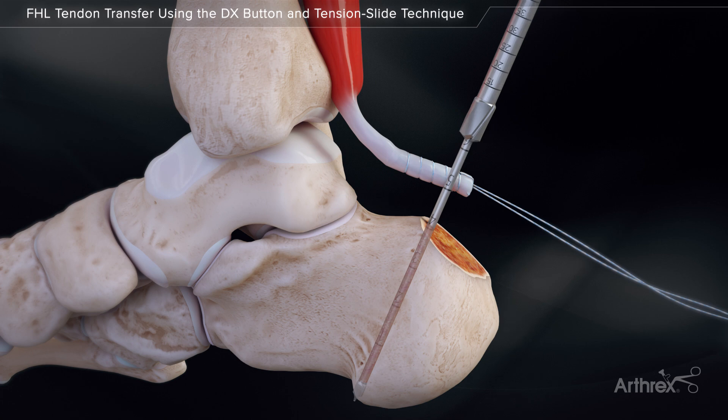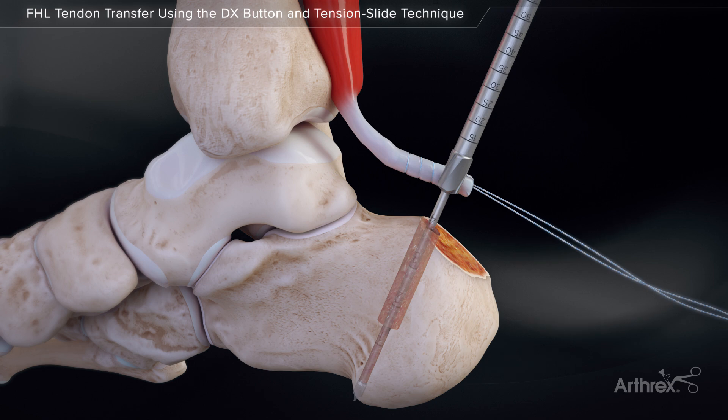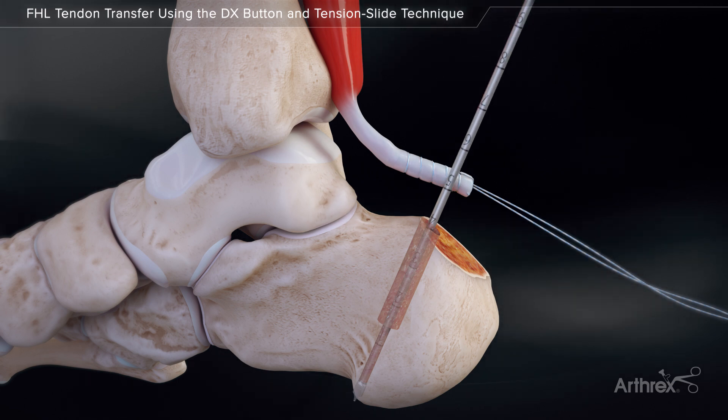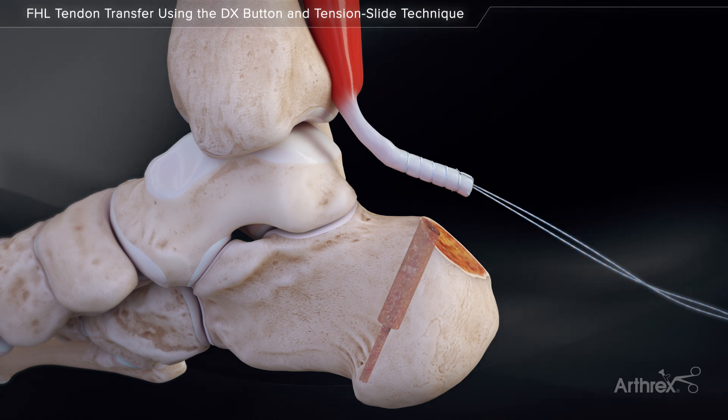Use the reamer in the implant system. Drill either 20 or 30 mm based on screw length. When reaming over the 3.2 mm spade tip pin, make sure the pin does not push through the plantar fascia and skin. Remove the spade tip drill pin. Irrigate to remove bone debris.